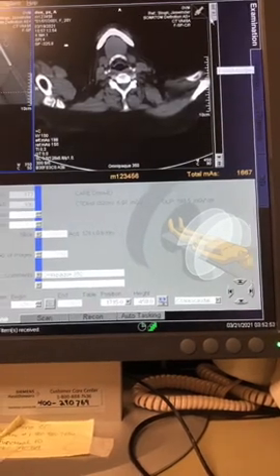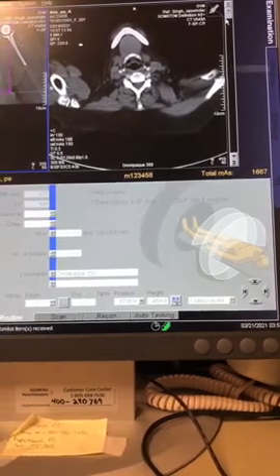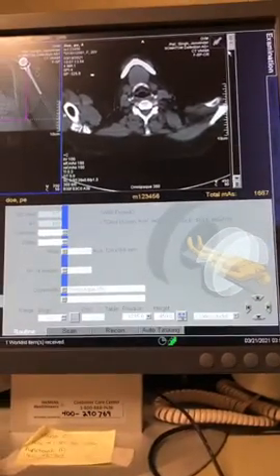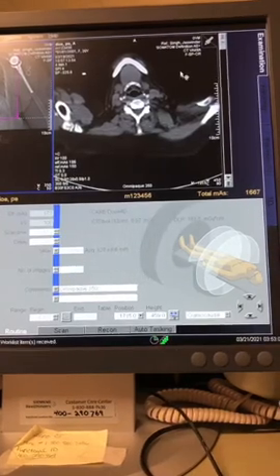This was going in at 6 cc's a second. You only get one shot. It happens so quick that sometimes my stomach hurts, right? Because I've had a lot of extravasations. But as long as you do it right, there's nothing to worry about. So let's see if we got a diagnostic PE. It triggered.